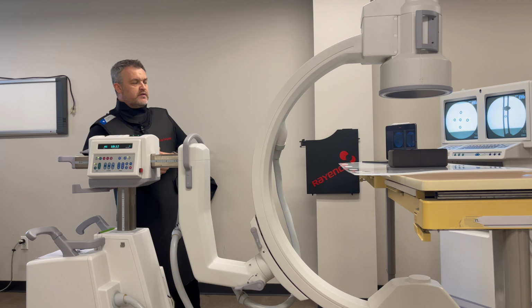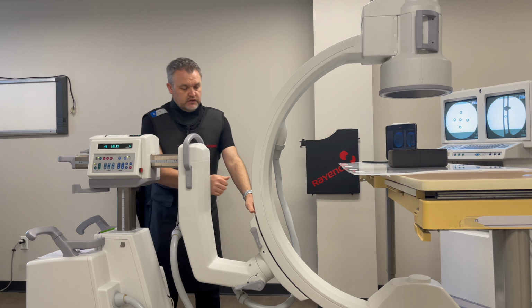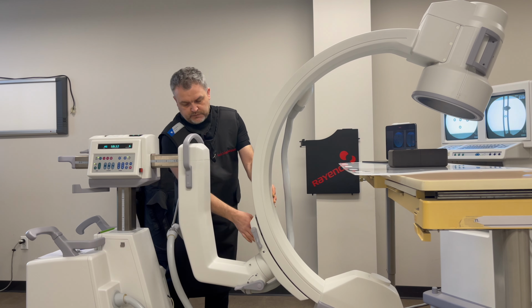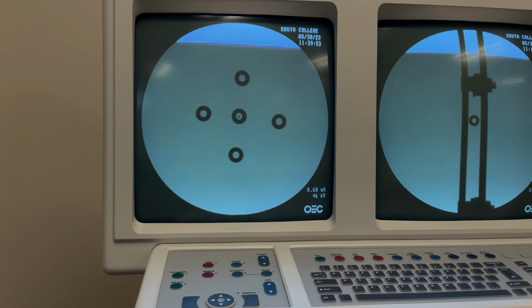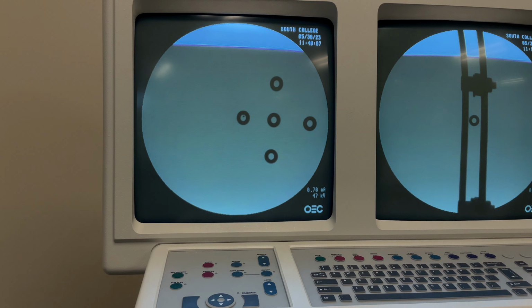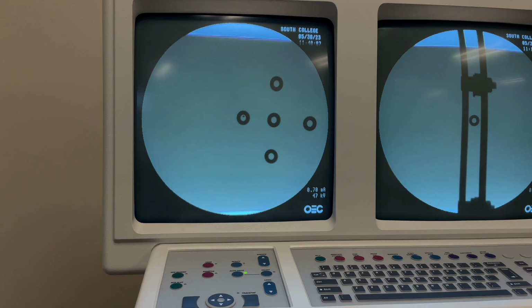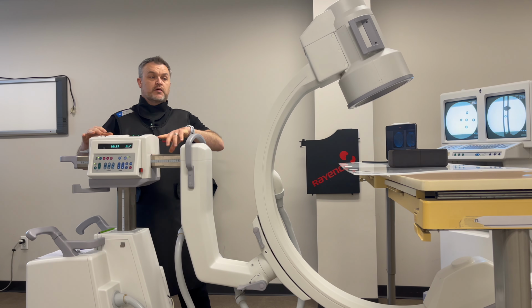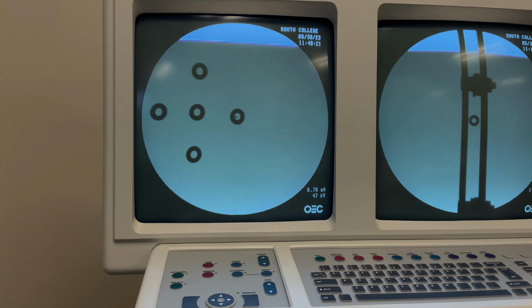And you can see the BB is placed directly in the washer. If I had to go back to my obturator oblique, I would apply my rollover and then come back to my marked position. Picture. Again, BB is placed inside the washer. Now if we want to go back and see that iliac oblique, I'll come back to my marked position, push in until I find the mark I had on my boom, and again, you have a BB demonstrated there.